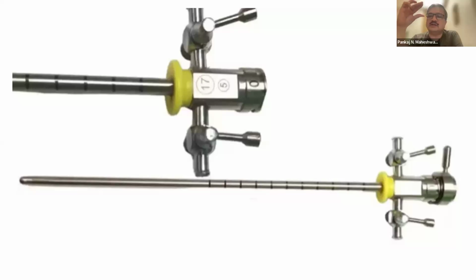So the possibility of the urethra getting distended is higher because the irrigation is an end irrigation. Another thing is that color coding is not fixed. Color coding is as per the company. If you go to Storz, the 17 French is green. So when the instrument is in front of you, you should identify the make of the company, which is written on it. After that, the color coding comes.